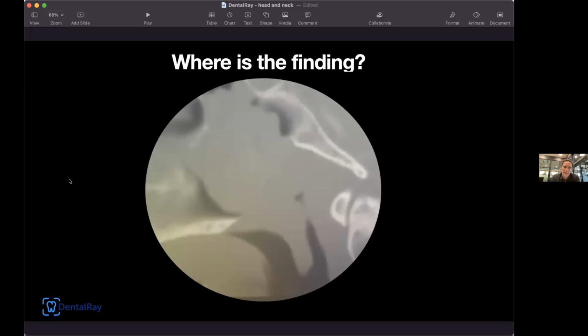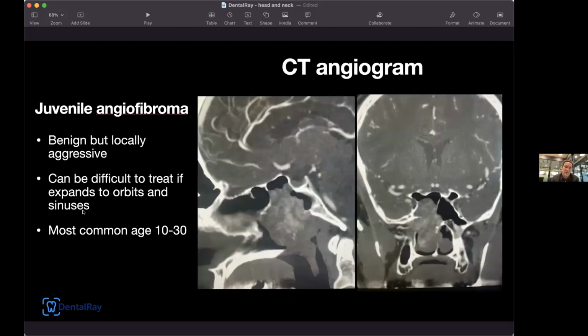Okay, so we're on to another eye test here. This is a small field of view in a sagittal plane, or looking from the side. And you guys probably recognize this as the hard palate, soft palate, uvula, and then the clivus, the bottom of the skull, and then the top of the cervical spine. This is the atlantodental joint right here. And so the atlas is holding up the skull, it's resting on that bone. This is where the nasopharynx should be. So again, this is an absence of black air, a tip of the iceberg type of lesion that's absolutely something that can be seen by cone beam CT.